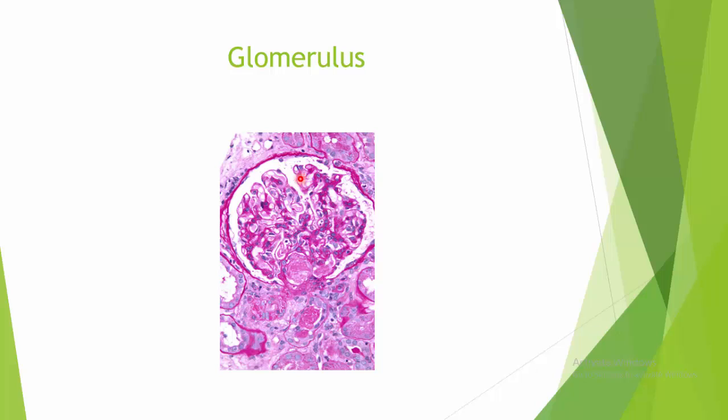See, here's an enlargement. You can get the idea of the bending and twisting. It's a convoluted capillary is what is in there, a twisting and bending capillary. And then these things around the glomerulus are all the tubules. Tubule is just a word for little tube.